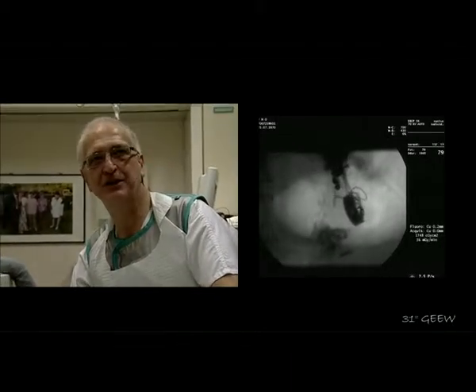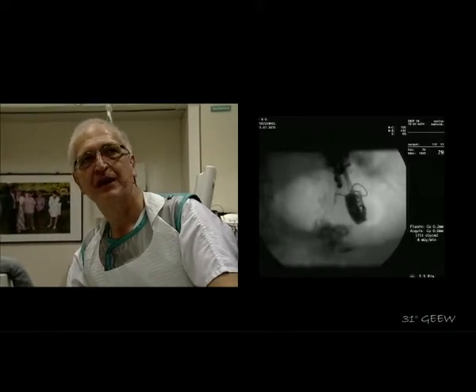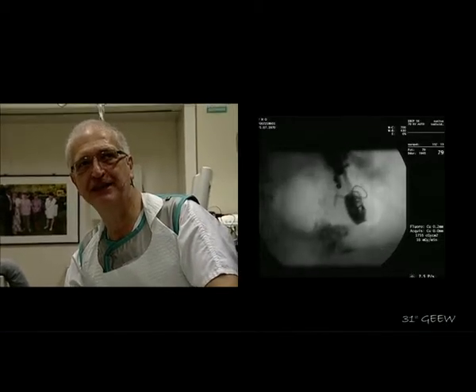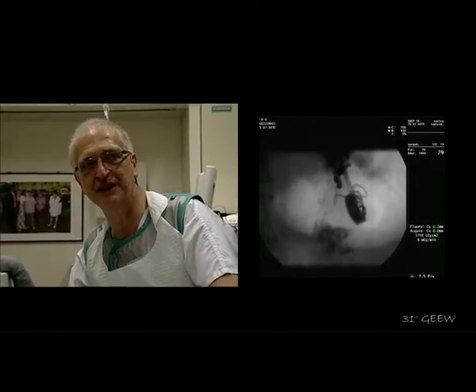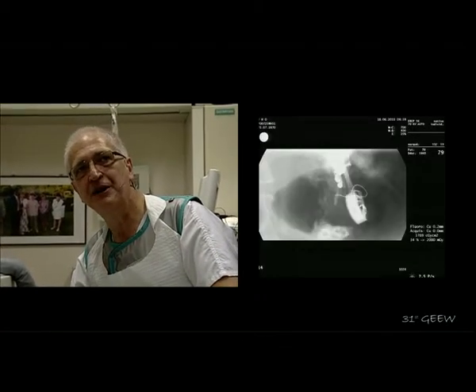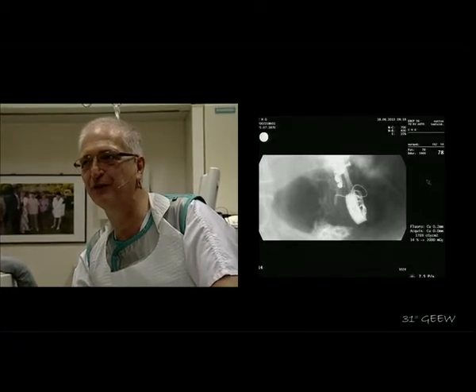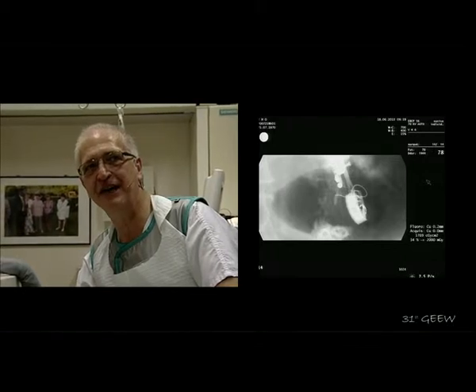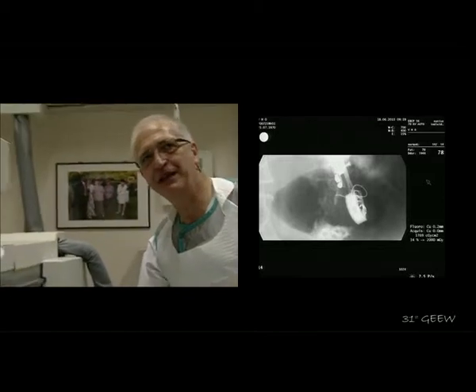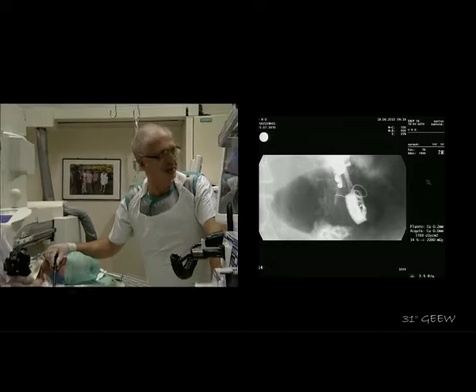Welcome back. Just a few minutes, maybe 2 minutes, to show you that we had to repeat the puncture 2 times, and you see that persistence is the key of success. Also, at one time we have also to decide to stop. So when we decide that we would stop if the last attempt would fail, then Mark again very nicely got the puncture of the duct, and we have been able to place a wire. We have been able to place the cystotome into the duct.